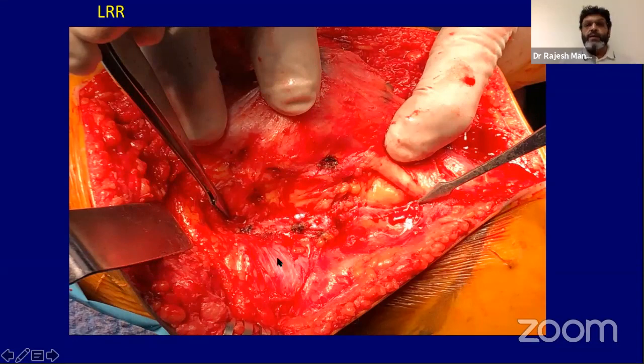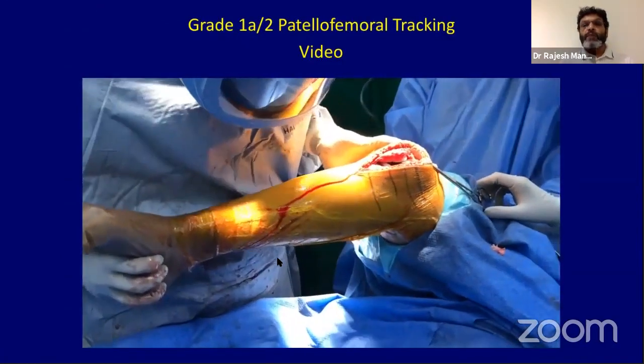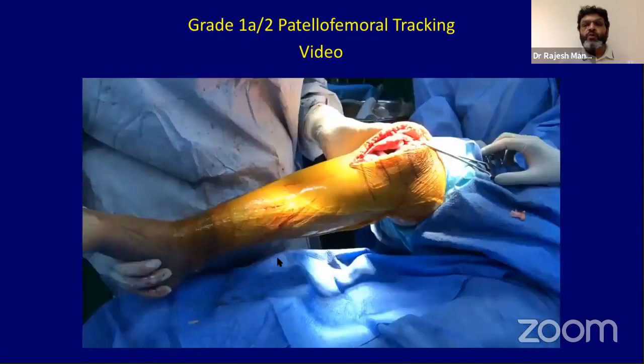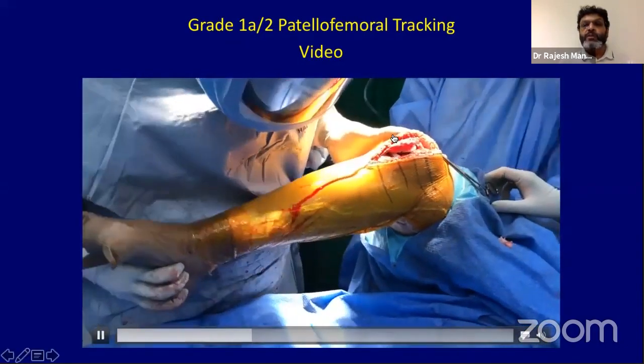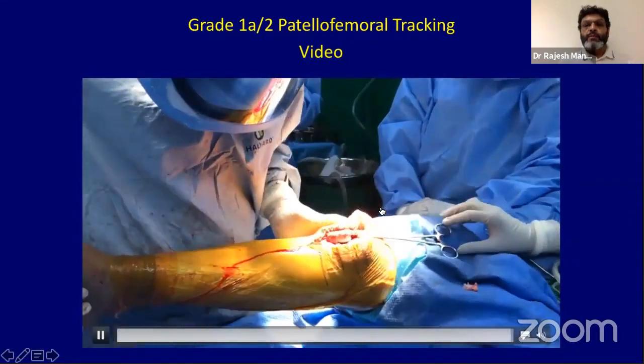This, and of course the correct rotation of the femur that I did, brought the patella back into position. But it was still, according to me, grade 1A tracking, or maybe almost falling to 2 if I remove that pressure from the thumb on that side. So I needed something more to track the patella correctly.